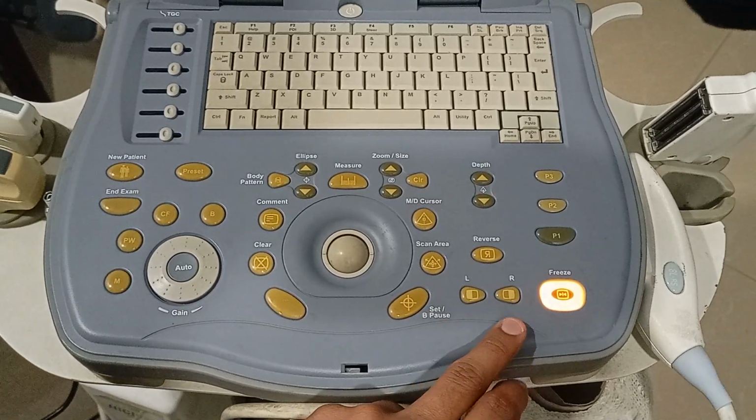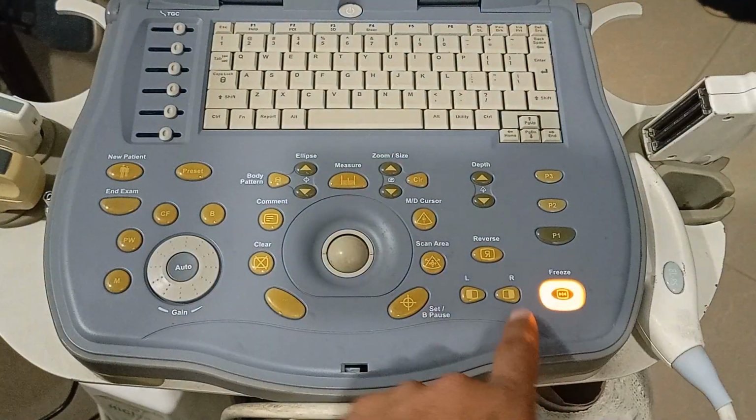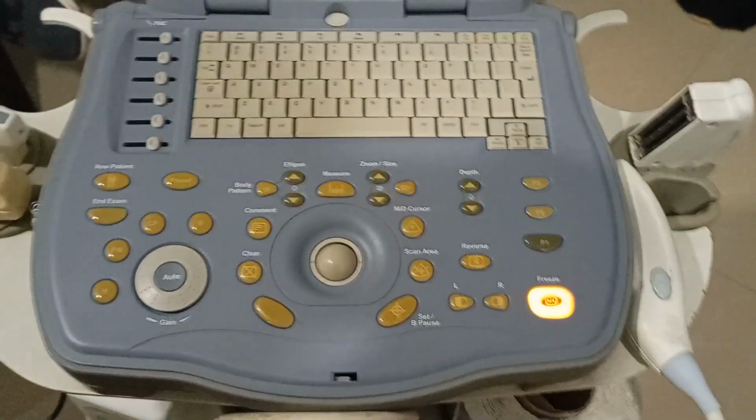You can freeze the right-sided images or videos onto the right side, and you can freeze or save the left-sided images onto the left side. So let me show you the right and left.